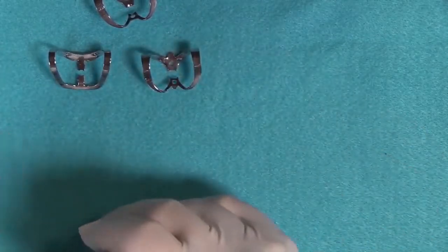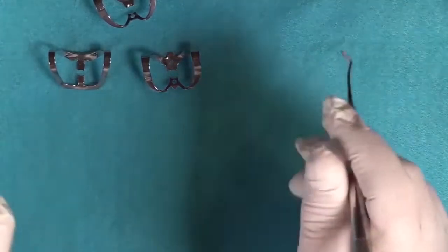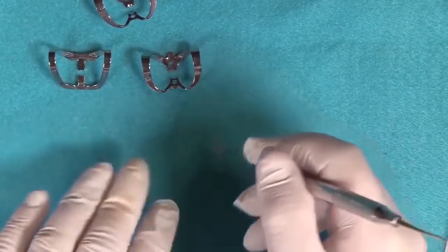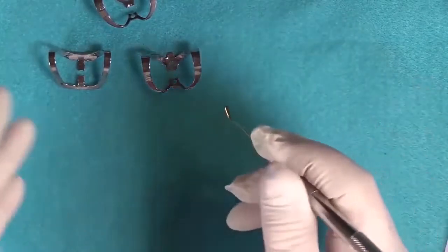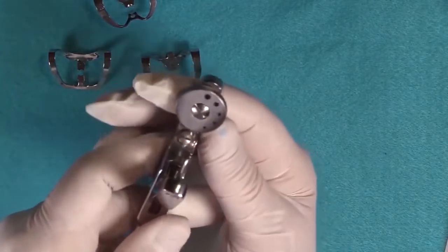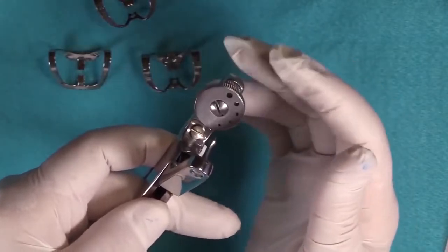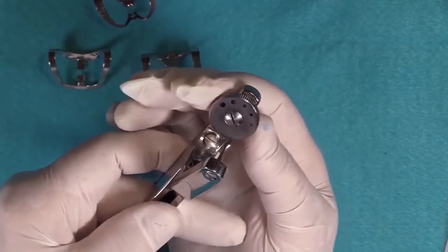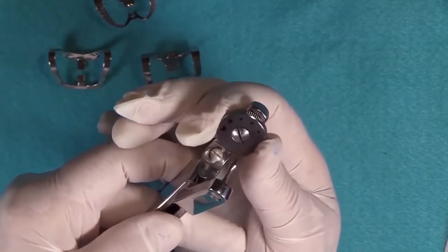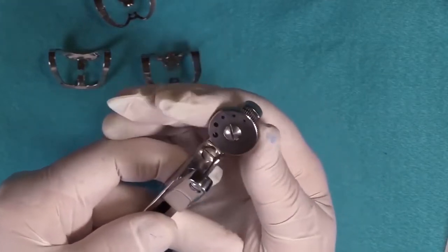When you do your hole sizing, we have a chart you'll be seeing very shortly that shows what hole sizes are appropriate for what teeth. Generally, the anchor tooth receives the largest hole in your punch, and it goes in descending order. For example, this is an Ainsworth style punch. It has 5 holes: the 5 hole for your anchor tooth, 4 for molars, and 3 for premolars and canines. The number 2 is for upper anteriors, and the number 1 is for lower anteriors.